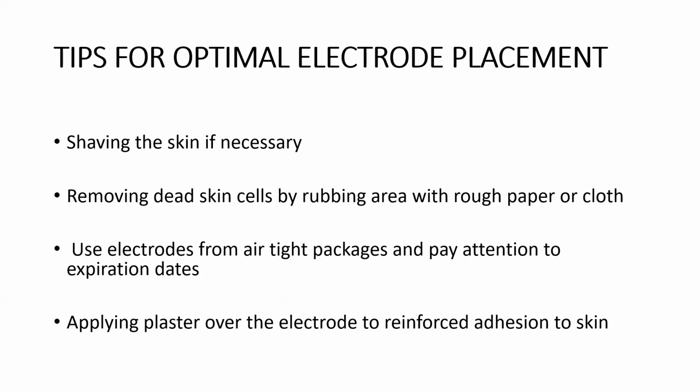For reinforcement, you can also apply plaster over these electrodes to prevent them from falling off, because this patient is going to be going about his or her routine activity for a whole day, sleeping as well. So those activities can distort and remove the electrodes.